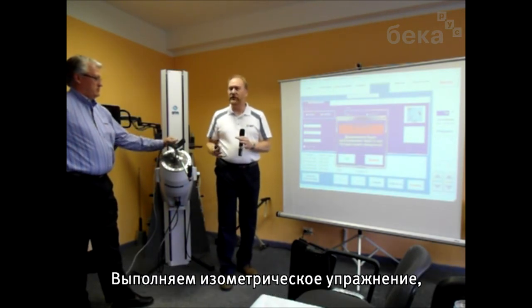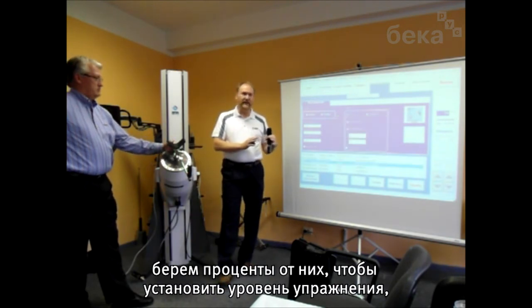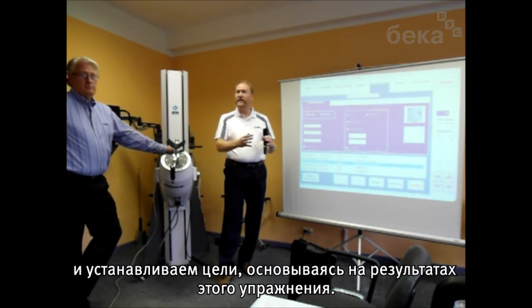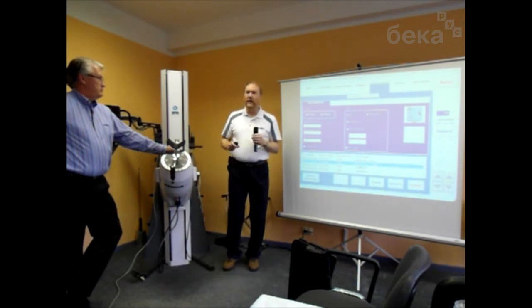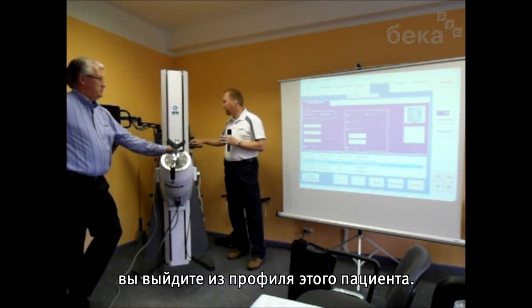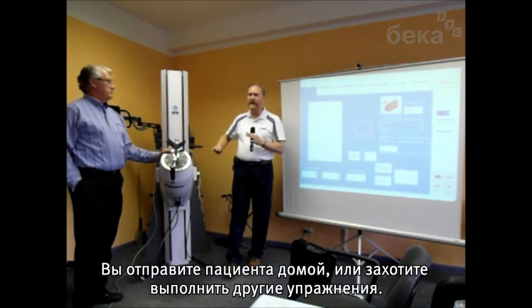Do an isometric trial to figure out their maximum, take a percentage of that to set the exercise level, have them work to fatigue against that level, and then set the goal for the next session based on the results of that exercise. Once you've completed the session for the day, you'll exit out of that person's record, go do something else with them or send them home for the day.